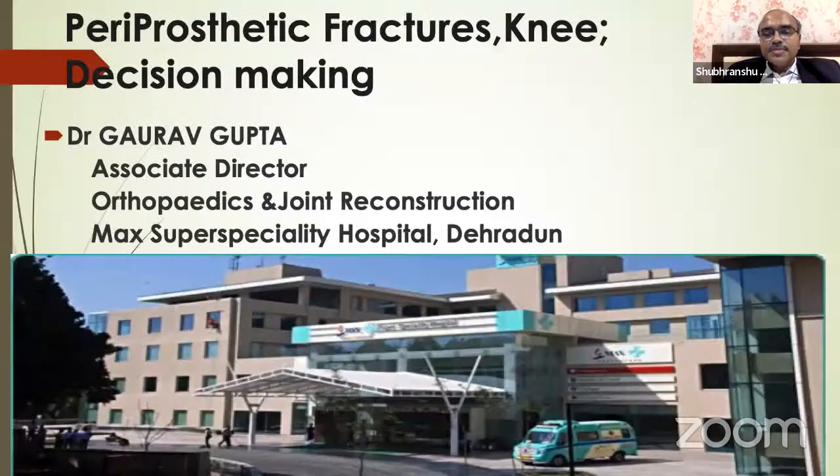While you're putting a screw and the cement, whether to use a stem extender or not depends on what percentage of the tibial surface the defect is. Suppose it is within 20% of the surface of the tibia, then you may not put a stem extender, but if the defect is beyond 20% of the surface, then I would put a stem extender. Moreover, if there are osteoporotic bones and your trial tibial component is not very stable, there I put a stem extender for additional stability.